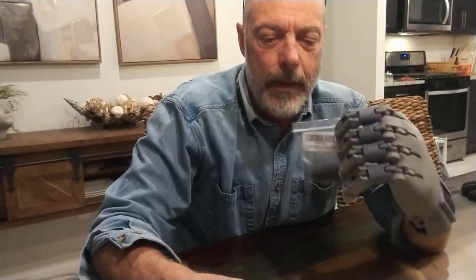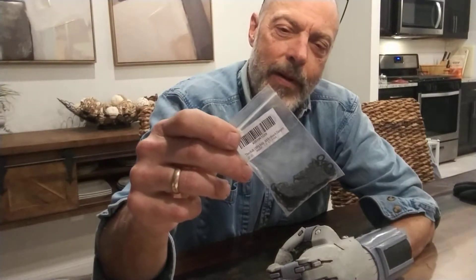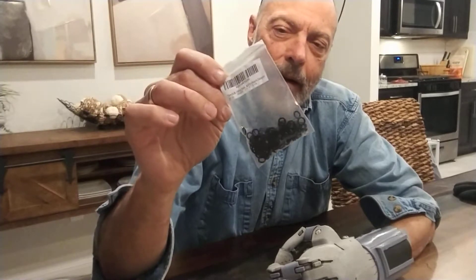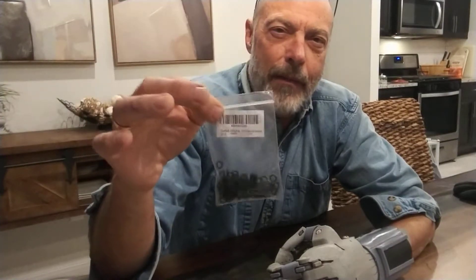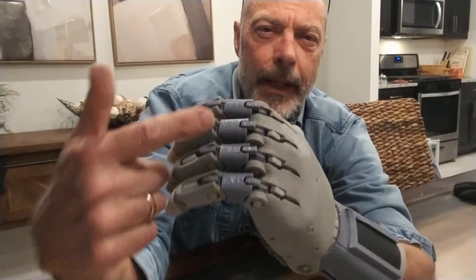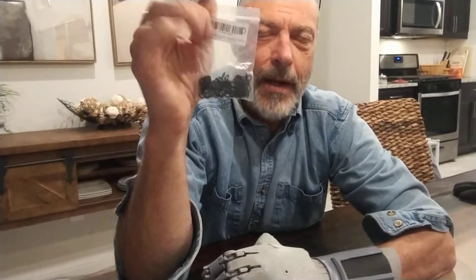A lot of us have used dental o-rings for orthodontics — latex — but they tend to stretch out and break. These are o-rings used for dampening the sound of keyboards; they go over the stem of your keys. Basically the same size, but they're tough, they don't stretch out, and they last much longer. You can get these on Amazon for a couple bucks for a hundred or so. By the way, this is a Phoenix hand — operated by bands between the joints that pull all the fingers open.